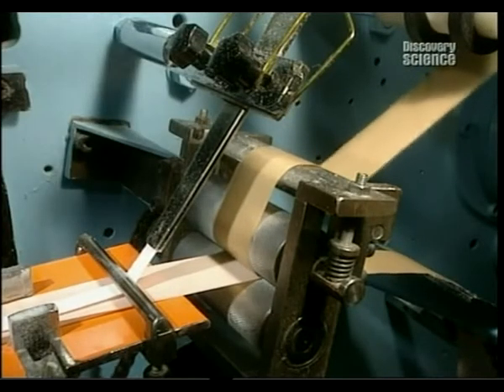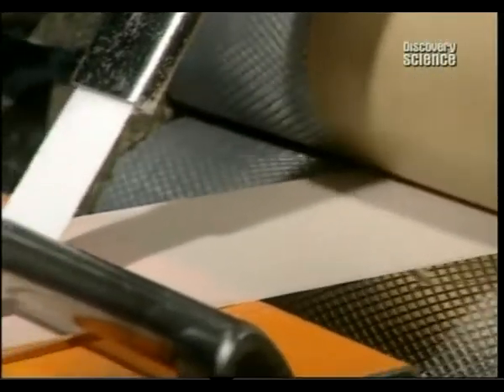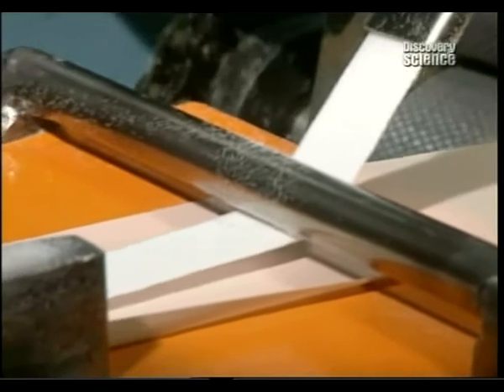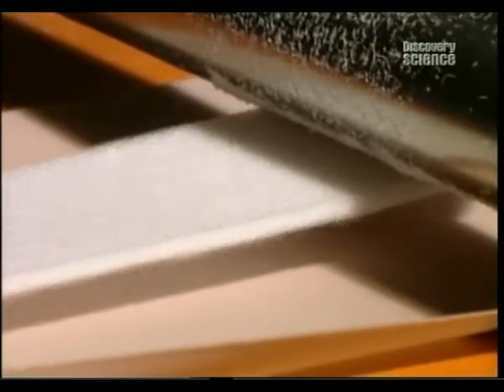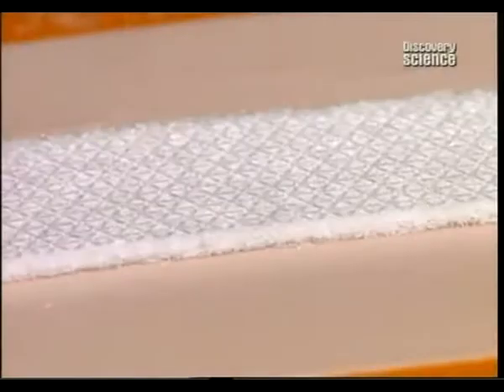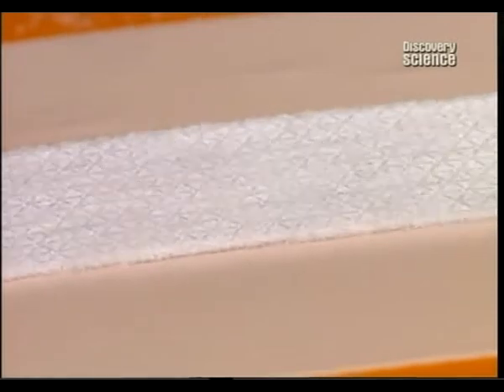Small plasters are fabricated differently. The cushion strip is positioned at the centre of the ETS fabric strip. The cushioned pad isn't yet sterilised. That comes later.